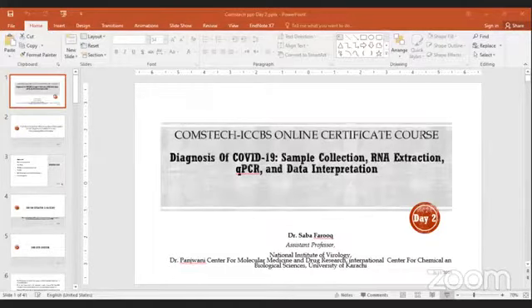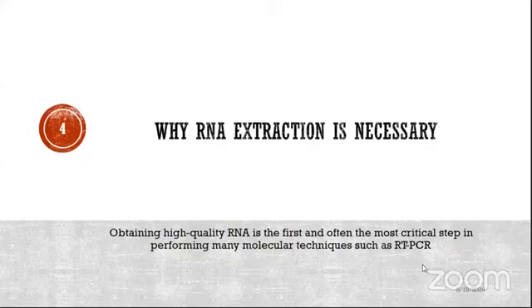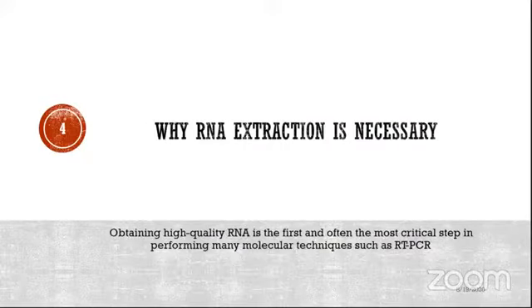In our case, it is COVID-19. RNA extraction is the most critical step for performing the diagnostics, in our case RT-PCR, because RT-PCR is the gold standard for the diagnosis of COVID-19.